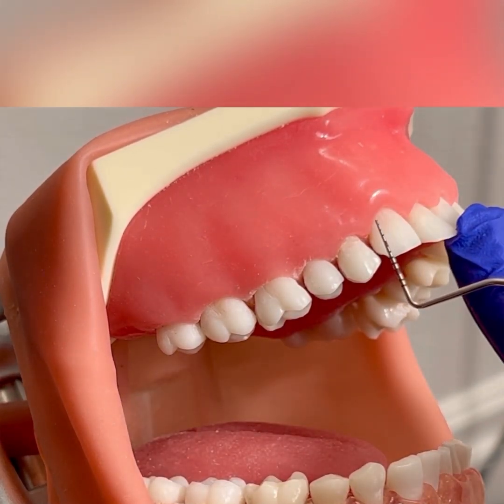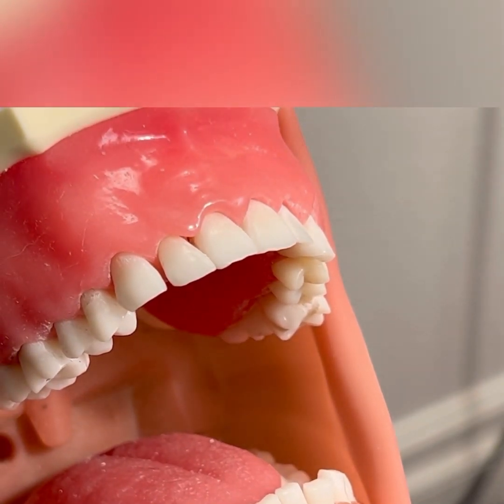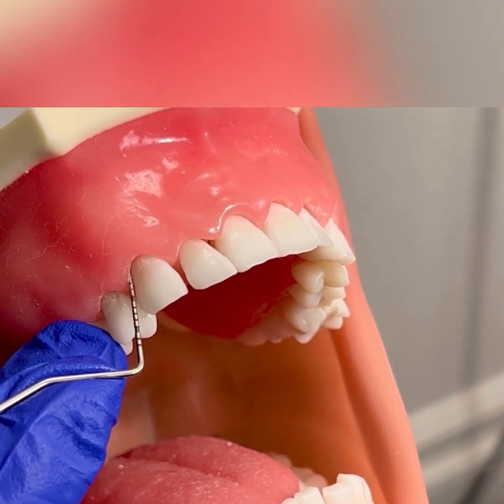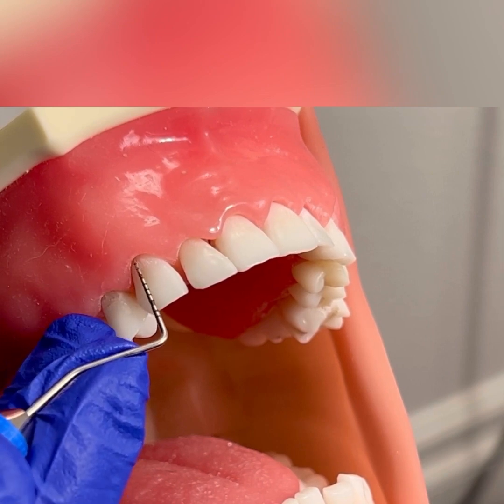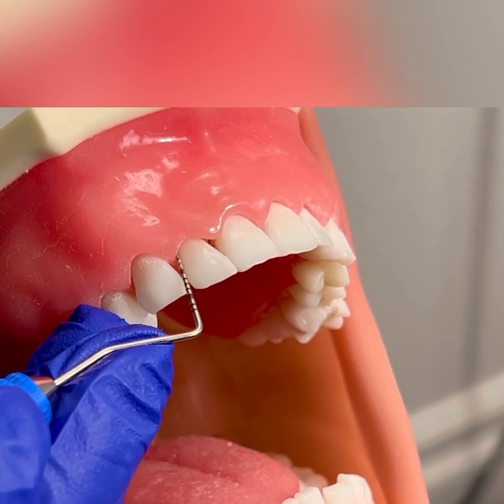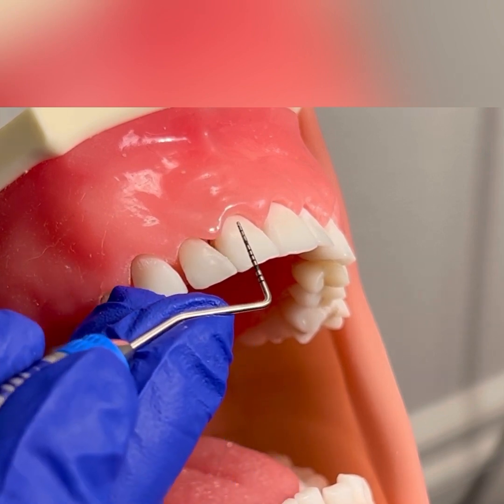When you get to the anterior sextant, you could sit at 12 o'clock. The chin would be up and the head would be slightly turned towards you. You would again start at the distal facial line angle, walking into the interproximal, continuing across the direct facial and into the mesial. Make sure you're recording your probing depth, maintaining your modified pen grasp and also maintaining your ergonomics.